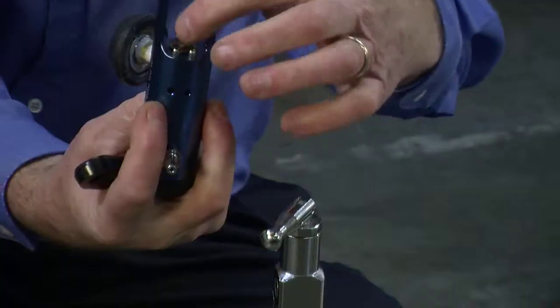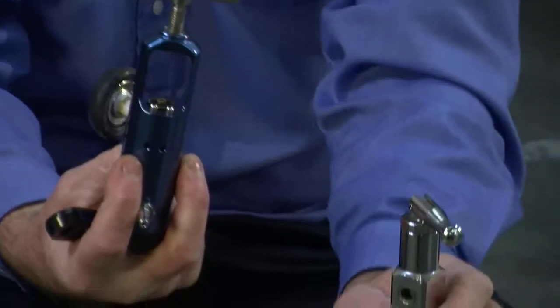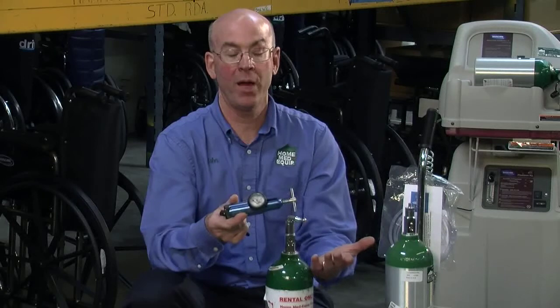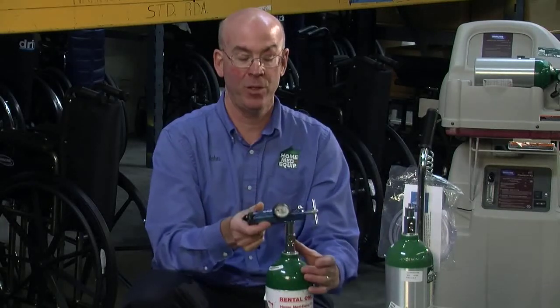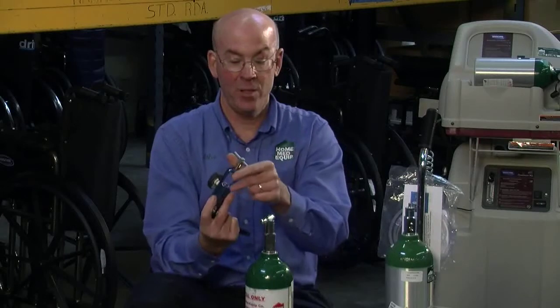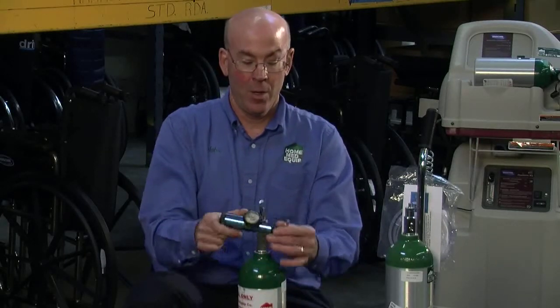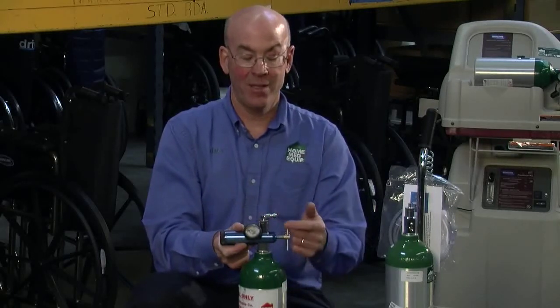The regulator has two index pins. The cylinder has two index holes, and to put the regulator on the cylinder you simply slide it over the cylinder, match the index pins with the index holes on the cylinder, and you'll feel the regulator mate to the tank.